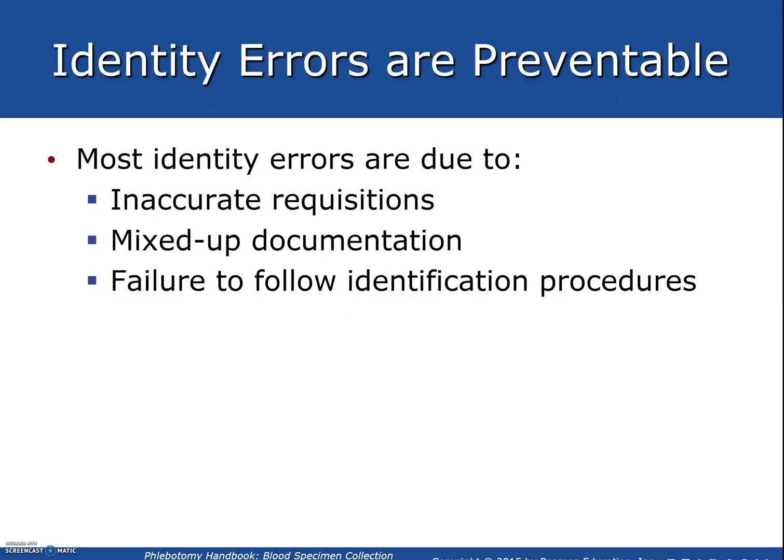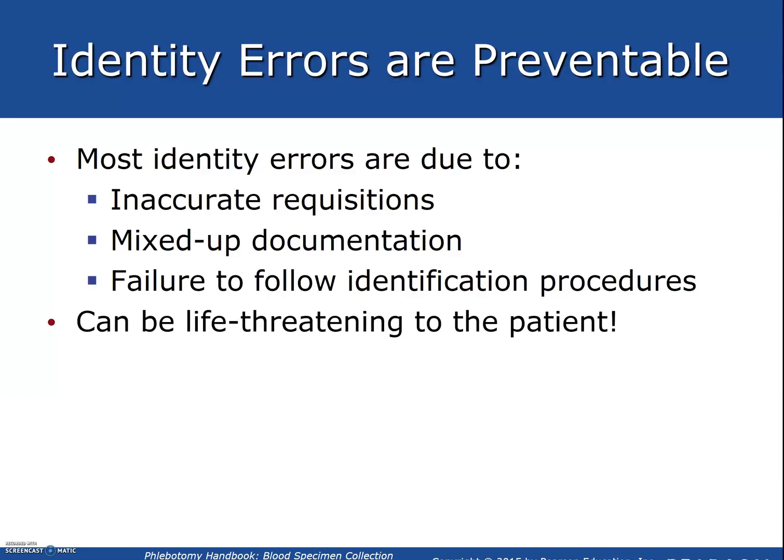Identity errors are preventable. Most identity errors are due to incorrect requisition, mixed up documentation, or failure to follow identification procedures. This can be life-threatening to the patient. Failure to follow identification procedures.